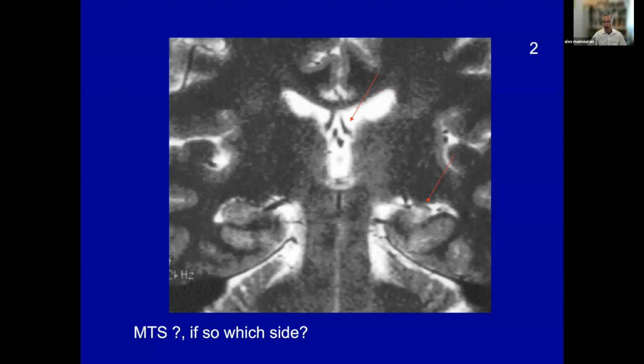And you need some high resolution T1 weighted imaging, if you're using Siemens, it's MP-RAGE or the like, that would allow you to look for abnormalities in the white matter. So yes, I can expand on that, and probably easiest if I just send you what I think is an appropriate list of sequences for epilepsy. Thank you.